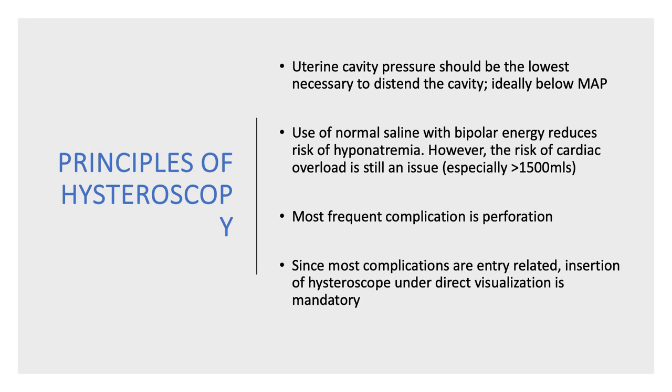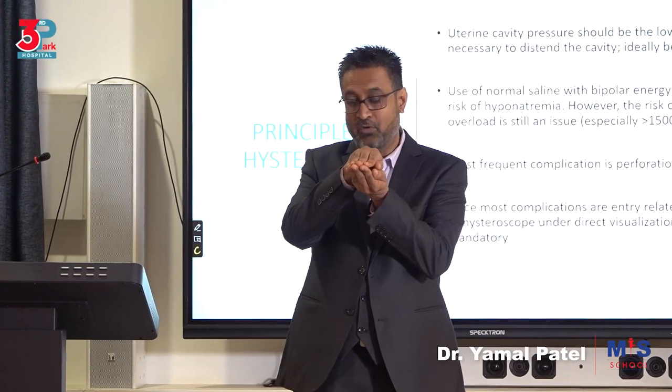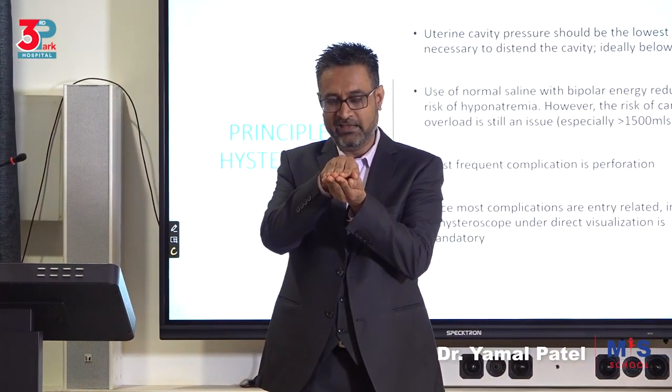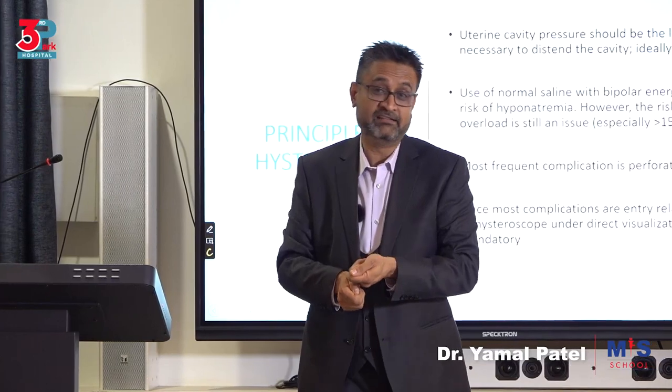So principles, remember, hysteroscopy is done in a very narrow and very small cavity, and it's a one-man show. One-man show means you're the only surgeon, you're the only assistant, you don't have two people holding things for you. And it's a one-handed surgery.